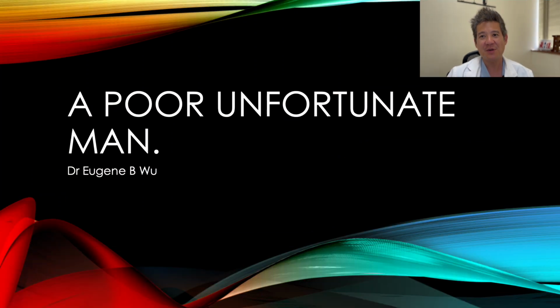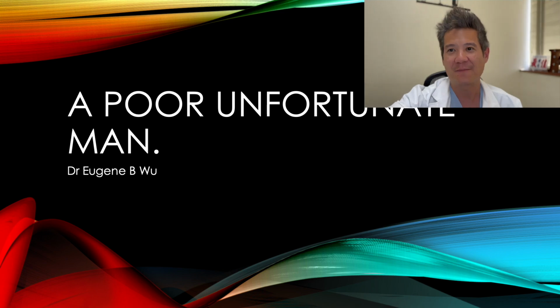I've been asked by my good friend Paul Kao to record a live in the box CTO master case for his summer meeting, TSCI meeting in Taiwan. The title of my case is A Poor Unfortunate Man.